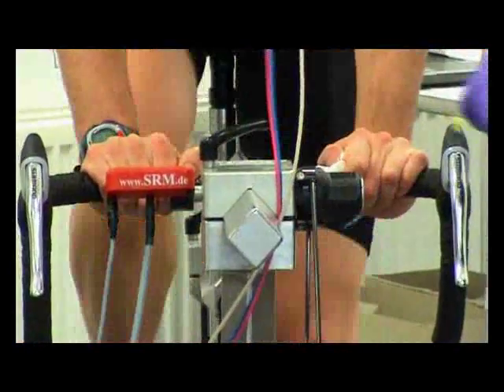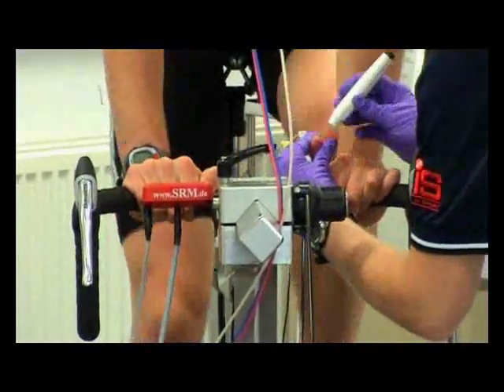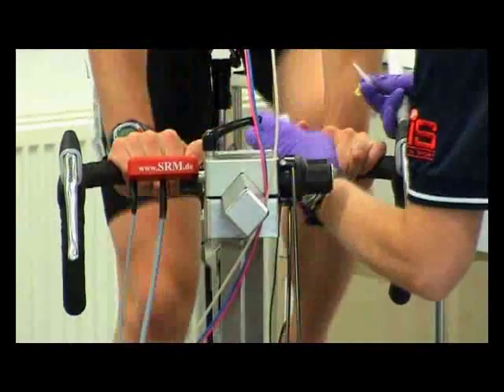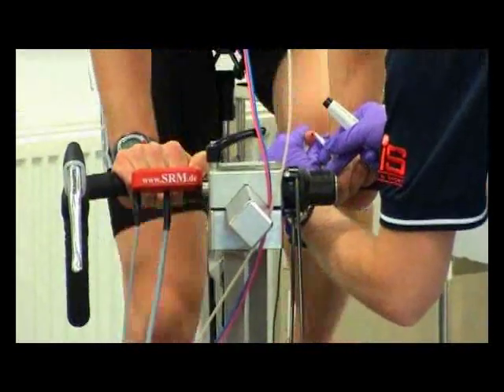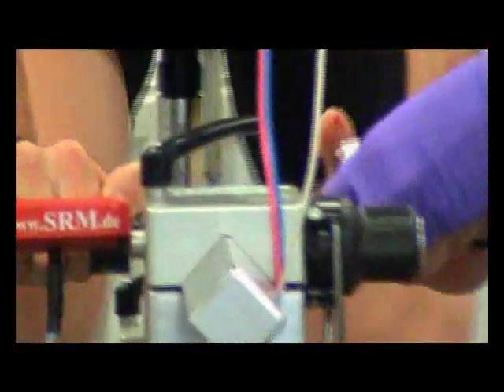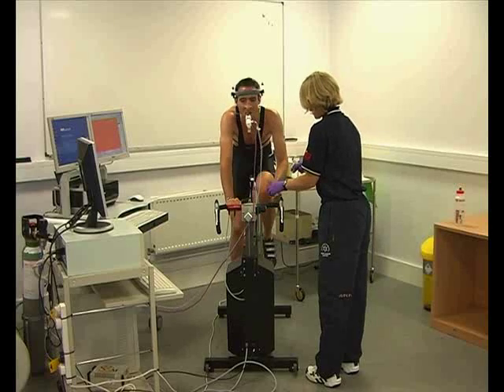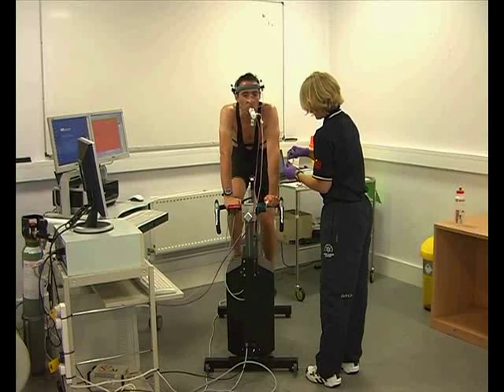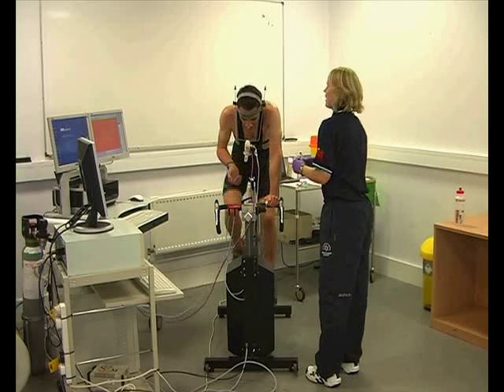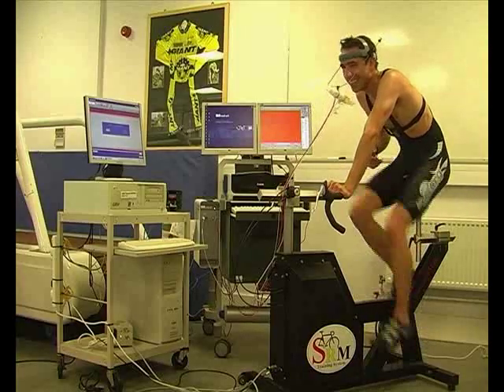The test has now ended, so it's time to get our final sample. The athlete can now just wind down their pedalling and look forward to the VO2 max test ahead. He's still smiling, so it can't have been that bad.